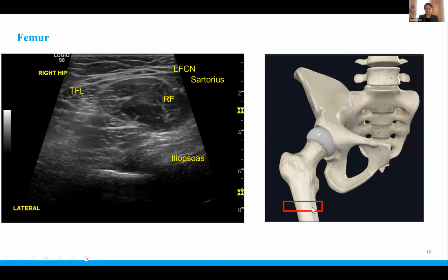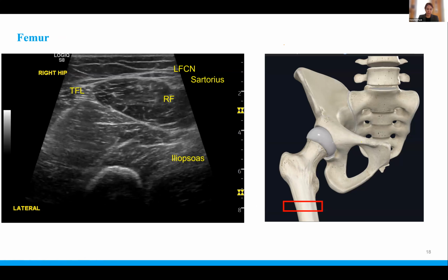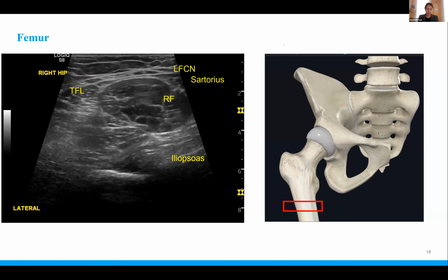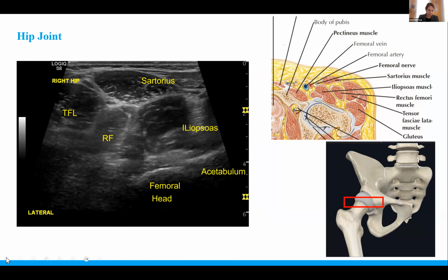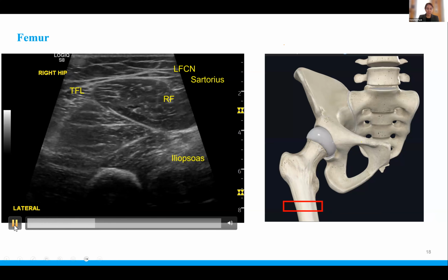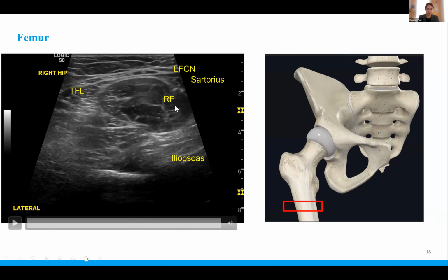We're starting again with the transducer in short axis. This image goes pretty quickly, so I'm going to repeat it a few times. So we're starting with that femur. It's nice and curved, and then it flattens out, and that's when we're getting to that lesser trochanter. I think it's good to keep that rectus femoris right in the middle of the screen, because it's a good way to keep track of where you are in space during the scan.